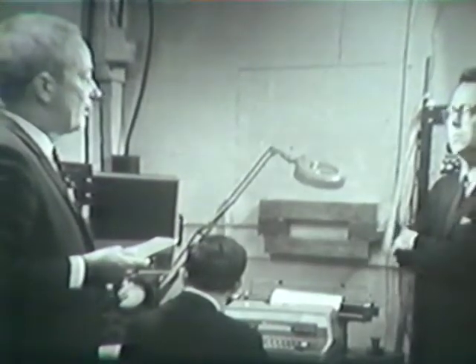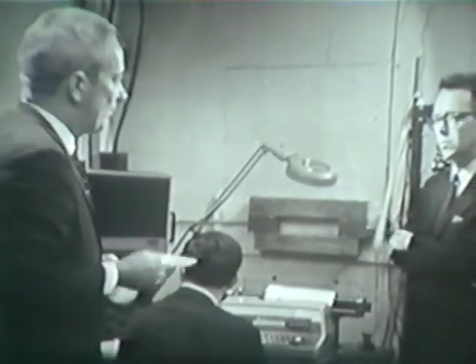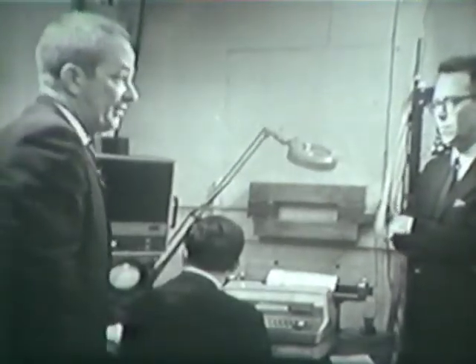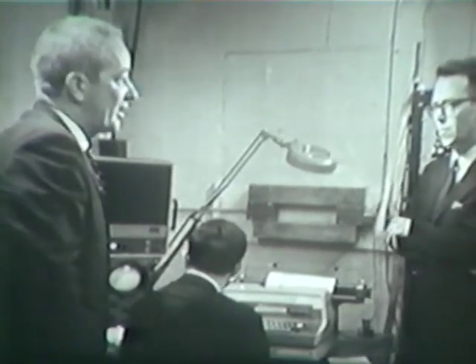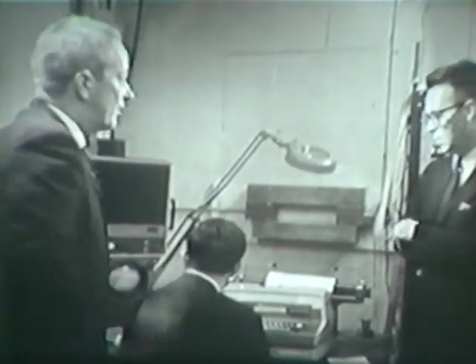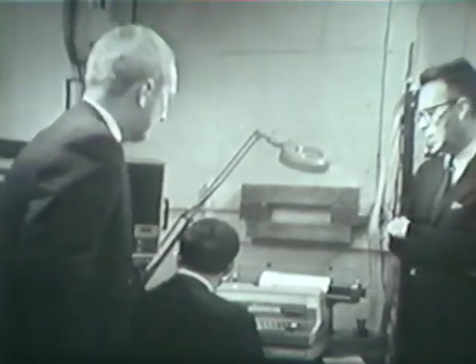But just before we do that, I want to mention that we've done about 50 characters here and it got one of them wrong. But we have done some testing on this material with larger blocks of material, and it's doing about 0.5% error. So out of every 200 characters, it might miss one. But this isn't too bad for a reading machine for the blind. In fact, some people think that a blind person could operate with a reading machine with an error rate as high as 5%. And so we're down to 1/10 of that right now.